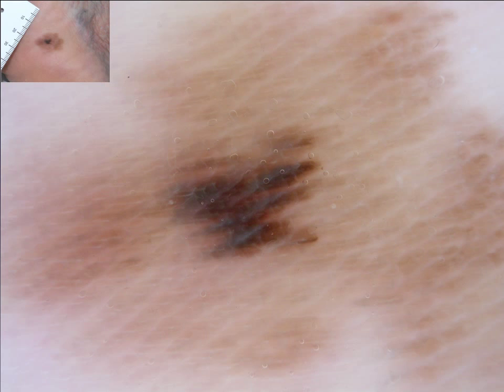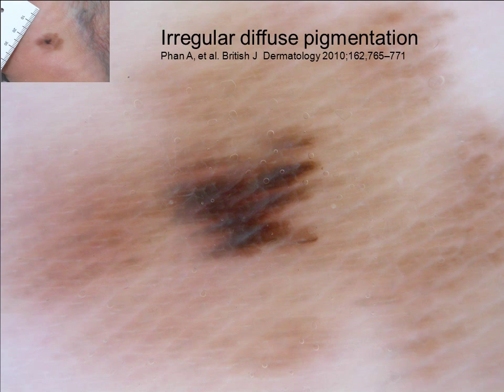If you are not sure where the furrows are, sometimes air bubbles can help you, because air bubbles are most frequently situated in the furrows. Another important parameter visible in this lesion is the so-called diffuse pigmentation, which was described by the group of Luctoma in 2010 as an important parameter for an acral melanoma.